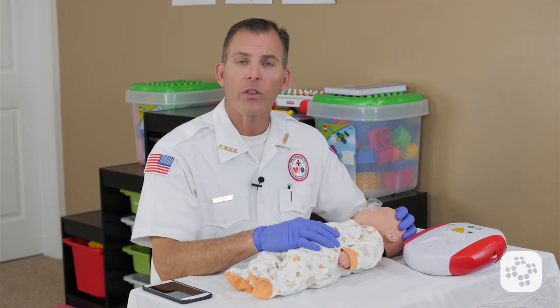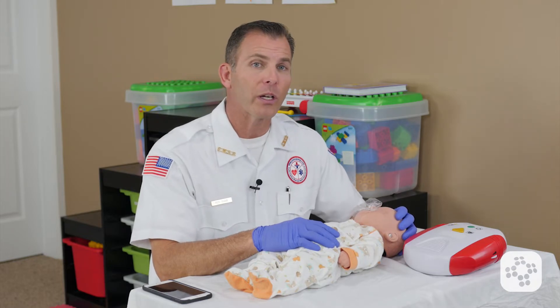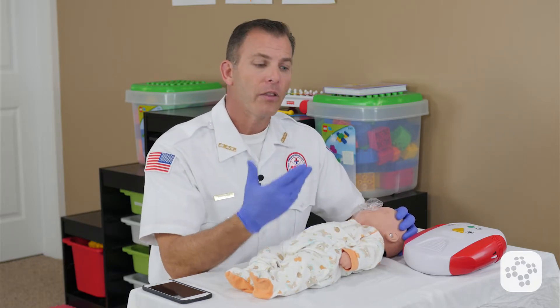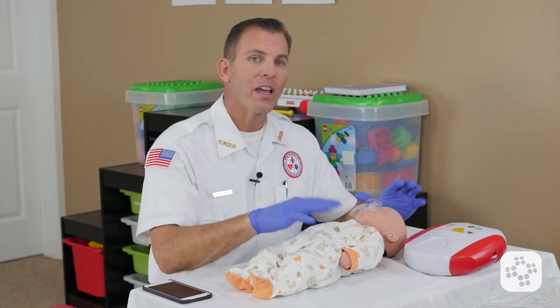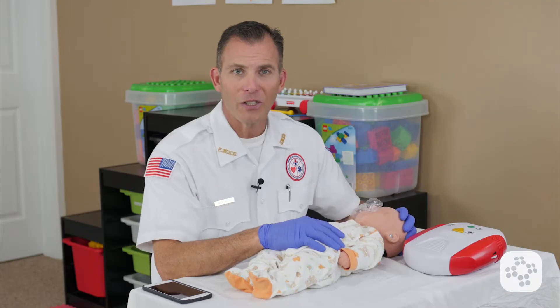Thirdly, there is the combustible issue. Are there any combustible gases, flammable liquids, or anything in the environment that would cause problems if there were a spark? If the scene is safe, then you're ready to use the AED. So let's continue.